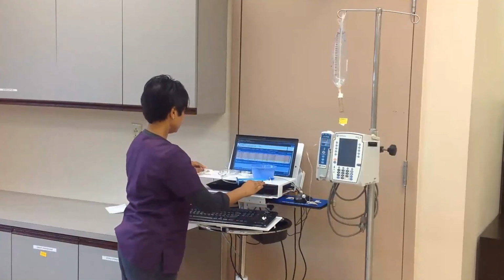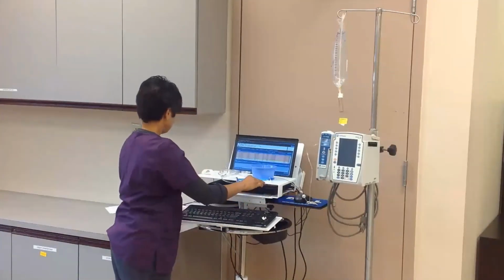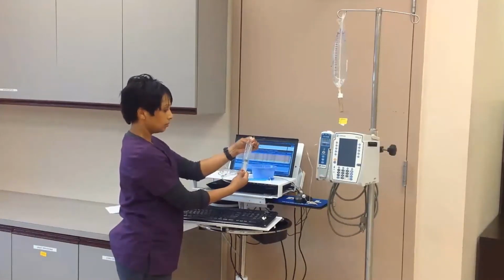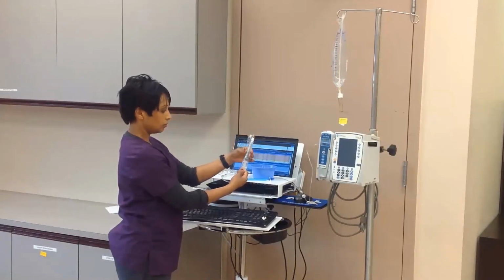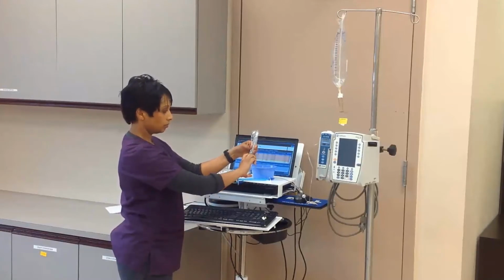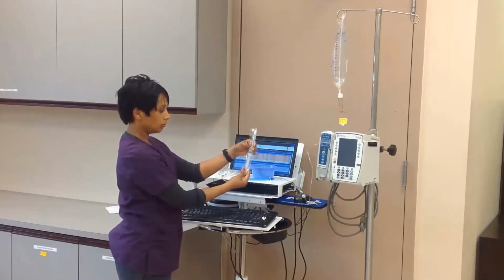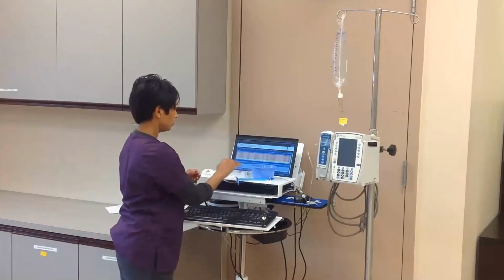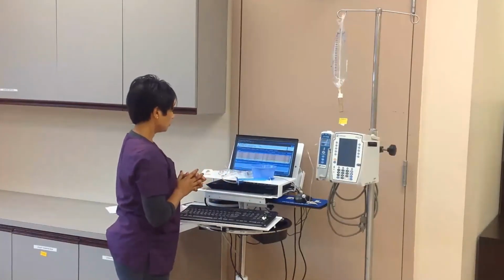Prepare your normal saline flush. Without opening the package, turn the white sterile cap a quarter turn and gently expel the air from the tip of the flush syringe. Remember to perform your 3 medication checks for this flush. This is the end of your second check.